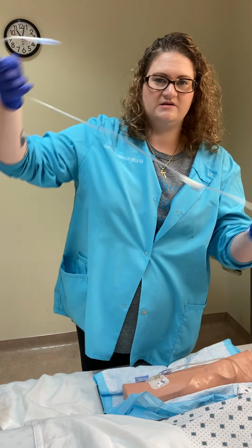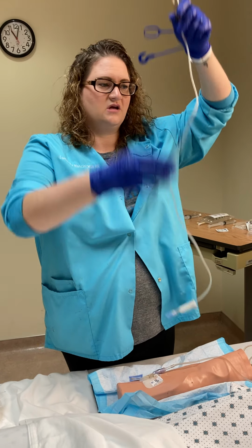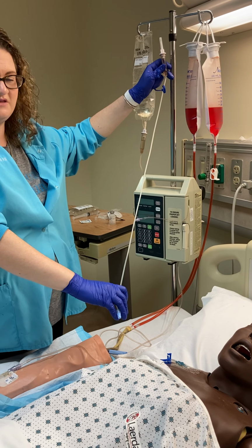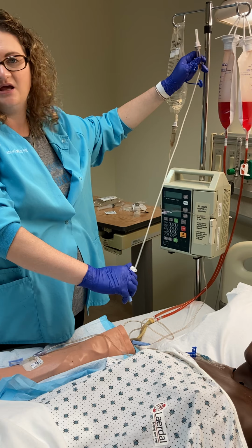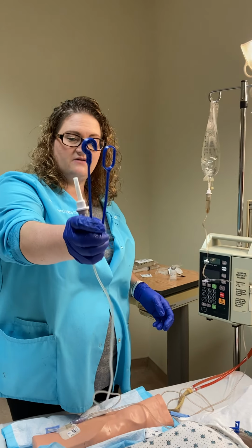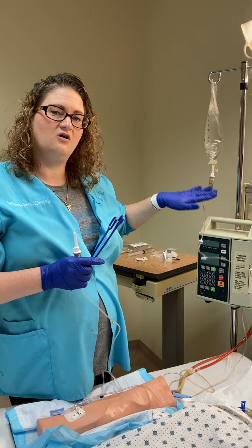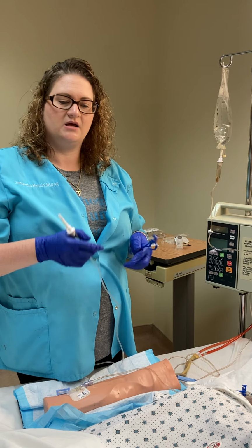And look how short this tubing is. So you're not ever going to connect this without a pump. It's not going to be safe. It's not going to reach your patient properly, and the medication's not going to go in properly with the pump. So we're always going to connect it up here. And you always have a little hanger because the primary fluid is going to hang lower than your piggyback, which is usually going to be like an antibiotic.